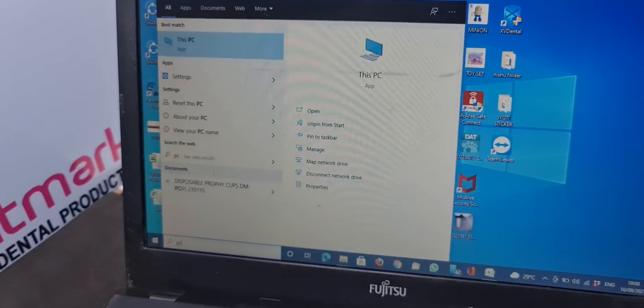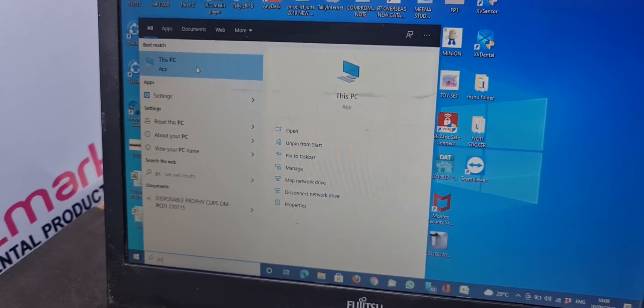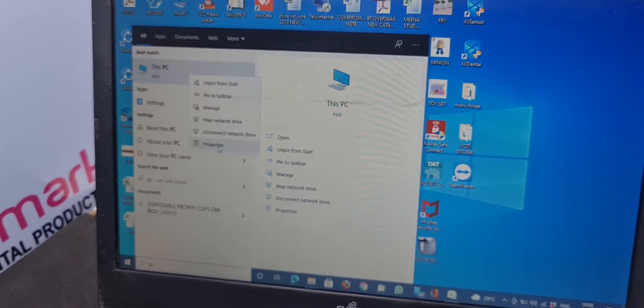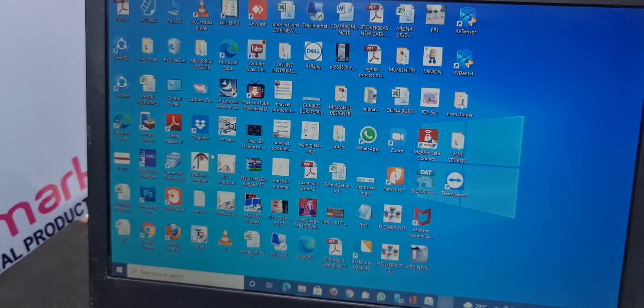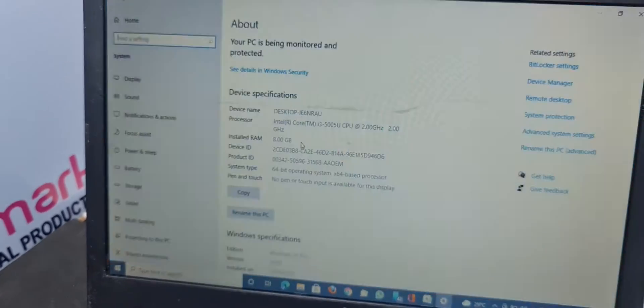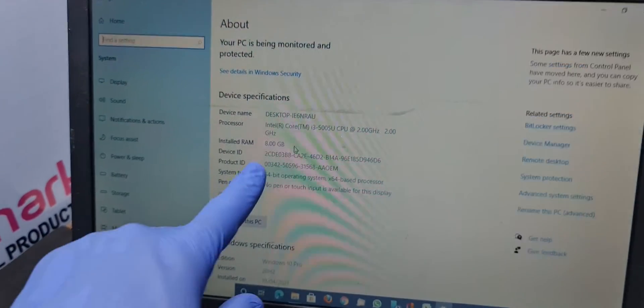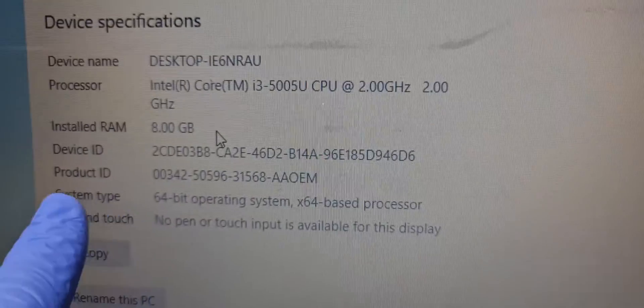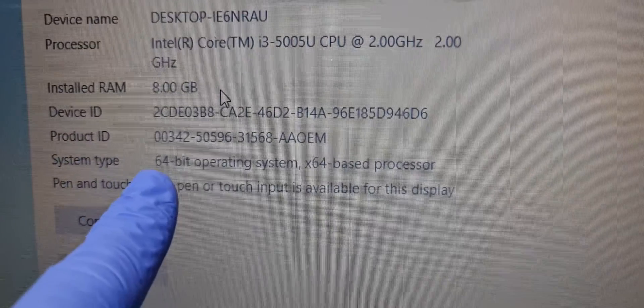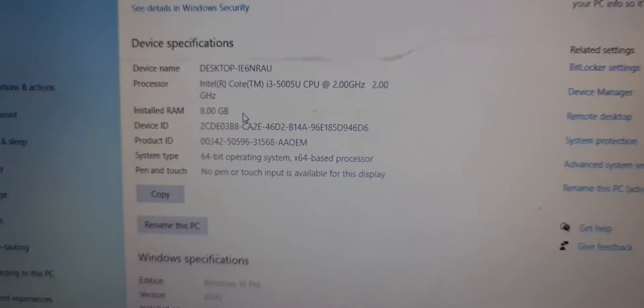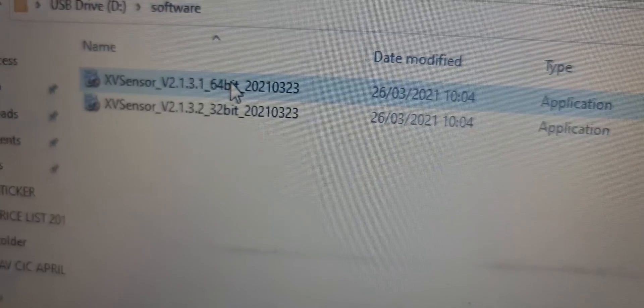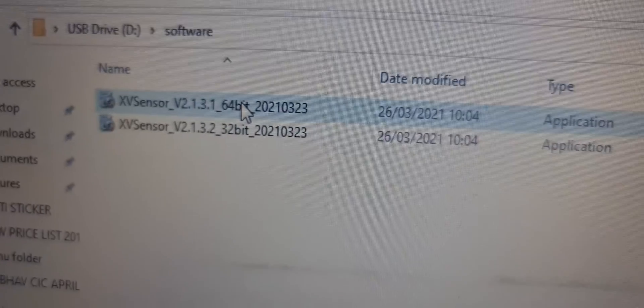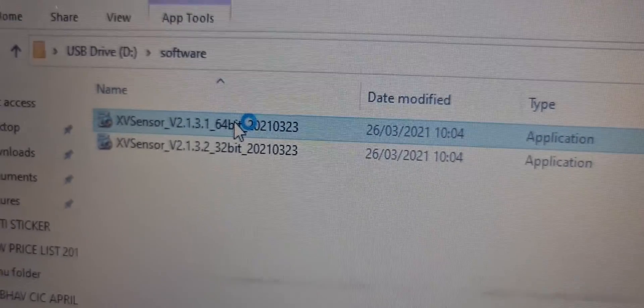How to check which Windows version you have, go to PC, right click, properties. So you can see here is system type 64 bit operating system. Only this you have to check, so I am going to install 64 bit version, double click.